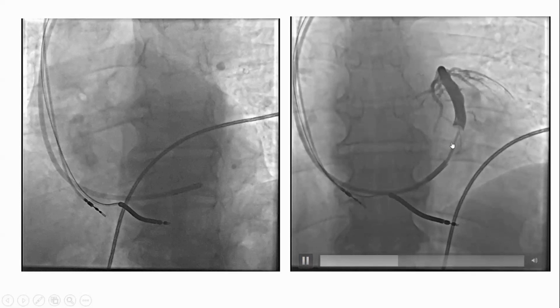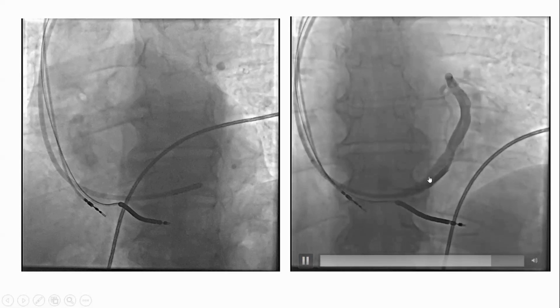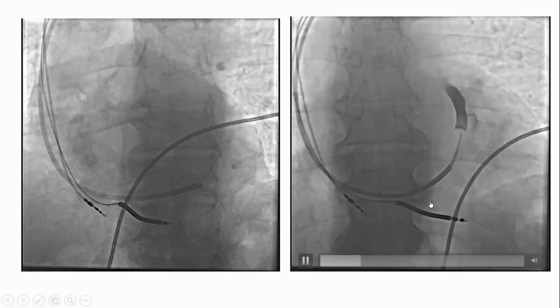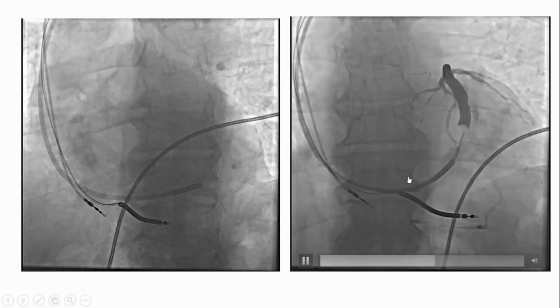And as the balloon deflates, the rush of contrast outwards also fills the proximal veins, and you can adequately visualize them. So a lot of the time, this is not done, and you miss the proximal veins. Right.